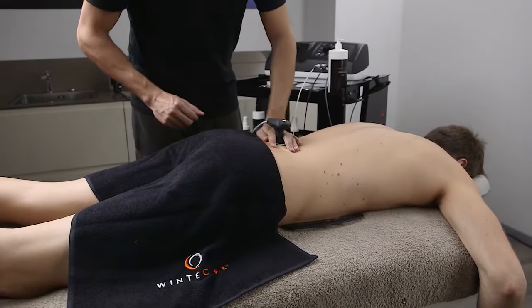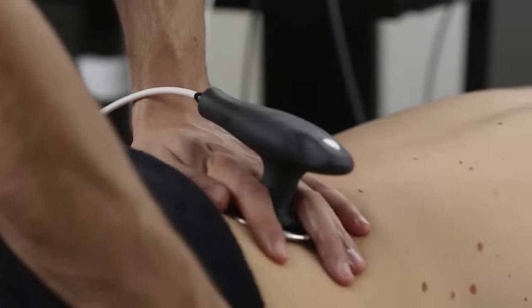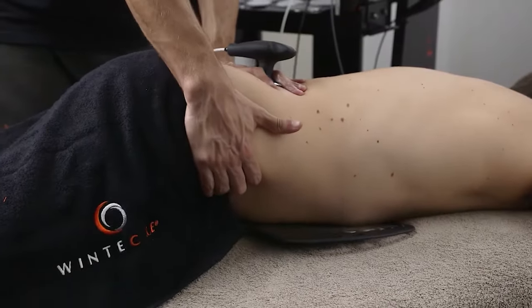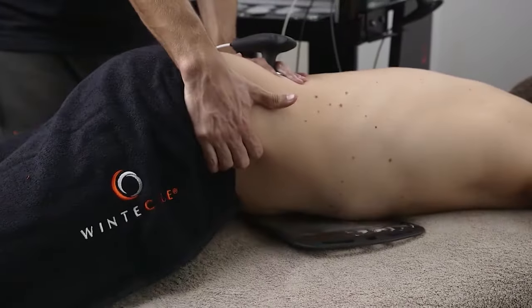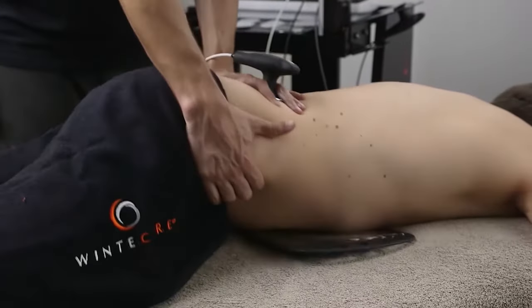Its control easiness, the ergonomics of accessories and specially designed contact surfaces make T Plus the ideal tool for those who want to combine energy transfer with manual therapy — the perfect ally for those who are result-oriented.